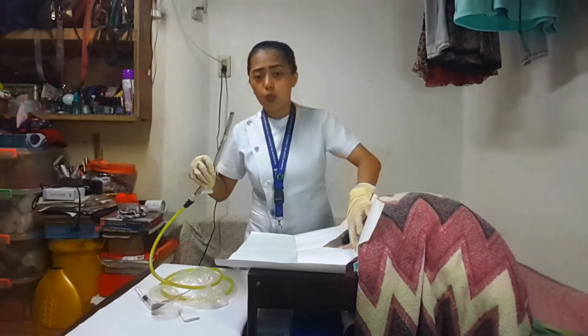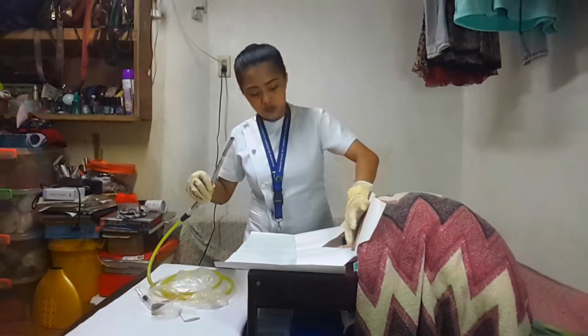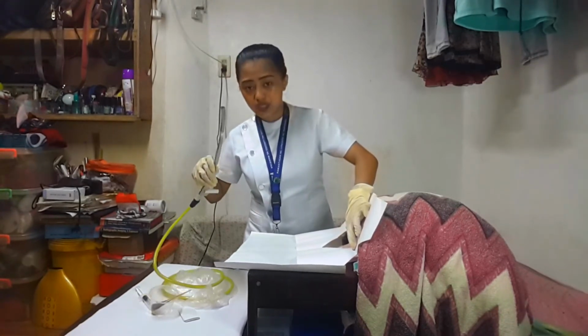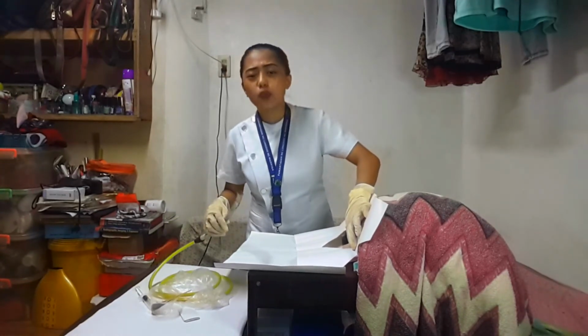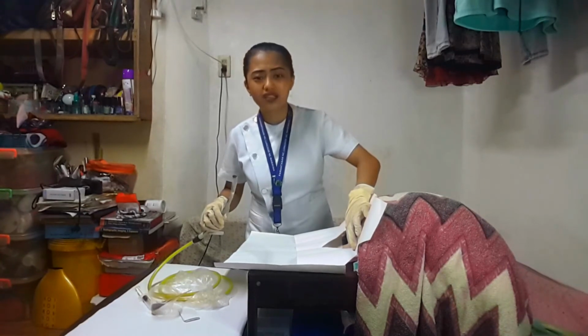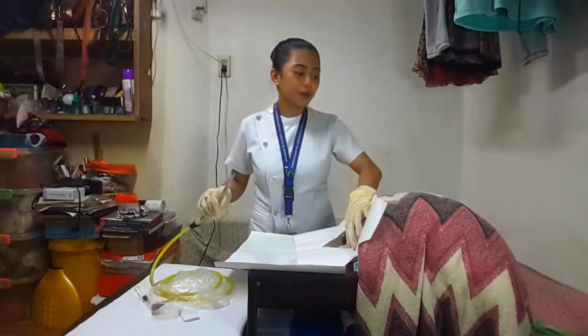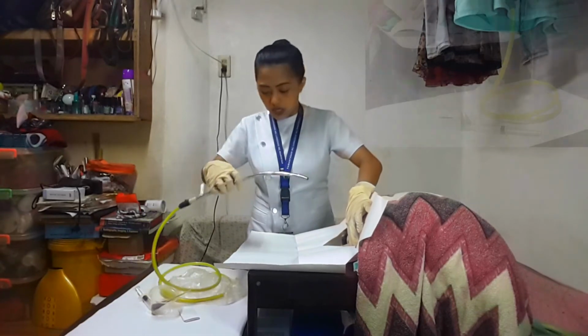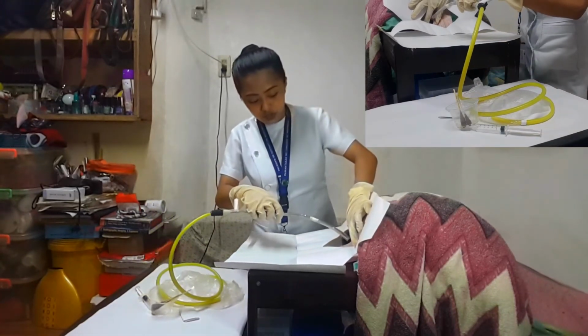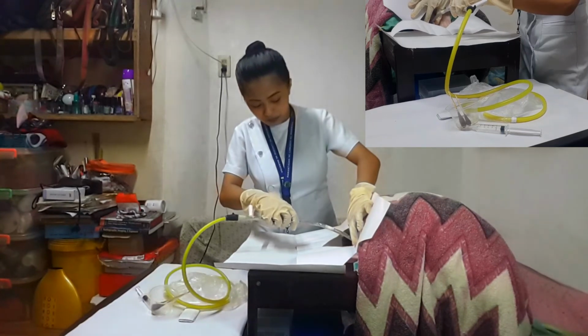Alright. So, after cleaning the labia or the meatus, we need now to pick up the indwelling catheter and then lubricate it for about 2 to 5 centimeters, or approximately 1 to 2 inches. So, now, we will insert the indwelling catheter to the patient. Before inserting, we have to inform and instruct the client that we will be inserting the catheter. So, ma'am, I will be inserting the catheter now. Alright, so gently insert it to the urethra.